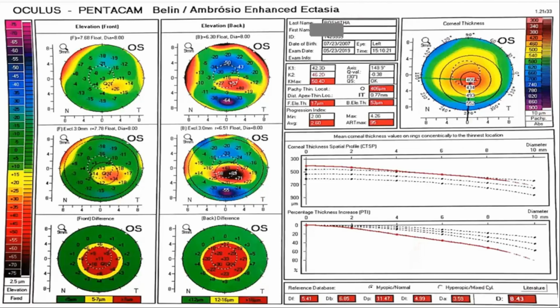Yes. Okay. So, any other comments, Dr. Amrita, Dr. Ruchika, anything? Yes, I think this part is very important actually. There are a lot of indices that we need to look at in the BAD maps, so I think it will be useful to discuss this a little more in detail.